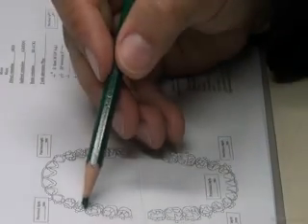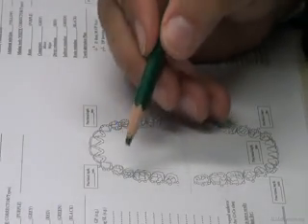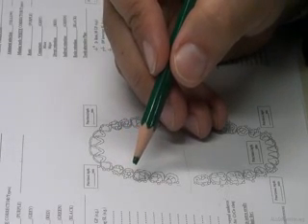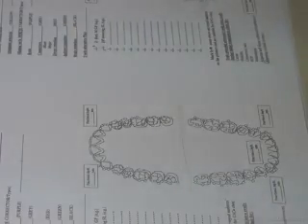Now sometimes, suppose this is a free end, and this is the abutment. Sometimes the undercut is not where I like. Where do I like undercuts in the abutment of a free end? What is the suitable undercut? Let's go back to the definition. What is the suitable undercut? A suitable undercut is where I want to end my clasp suitably to serve all of the biomechanical principles.